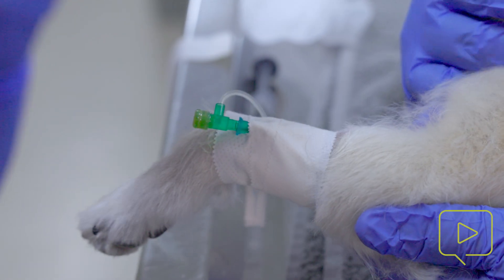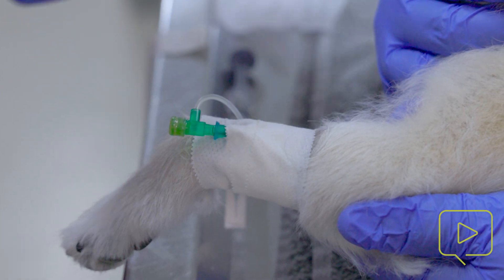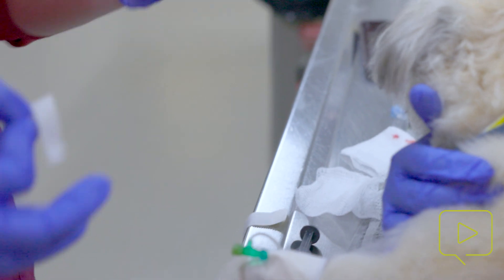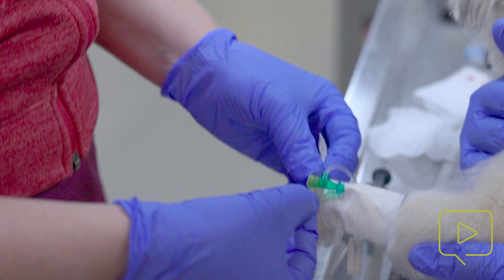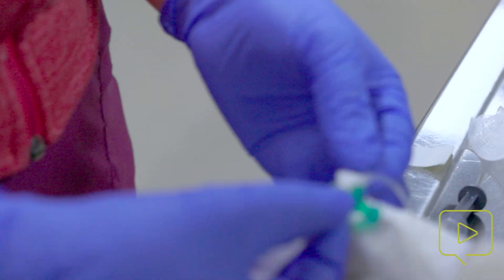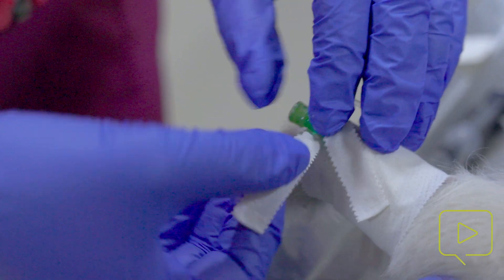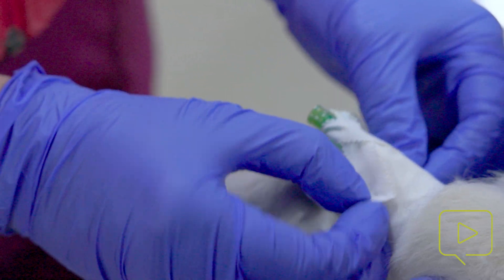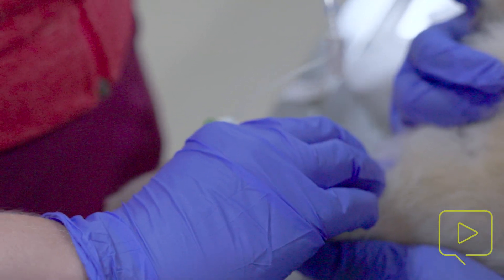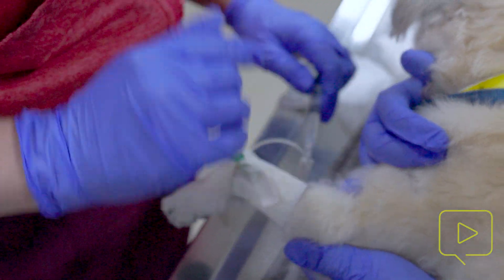The next piece is going to hold the T port in place. I'm going to take this thin half-inch piece, twist it in the center, sticky side up, and place it underneath the first part of the T port. I'm going to wrap it so it goes across the connection and holds it firm, then take the other one and crisscross to the other side. Both of these also have a courtesy tab on them. Then before I tape this down, I like to flush and make sure I can feel it go through the vessel and that I don't have any concerns.